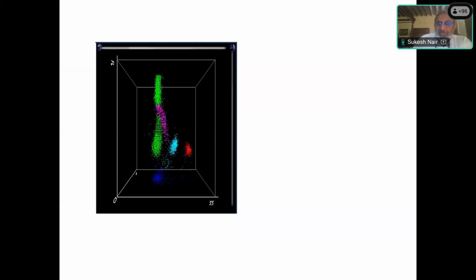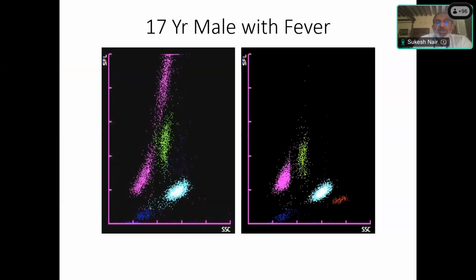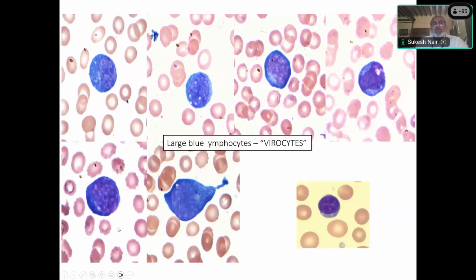got some abnormal lymphocytes, which are not lymphocytes, they're monocytes which are infected with the virus, because dengue virus is monocytotropic. If you compare to a normal person, you can see that he has an additional population of cells which are mononuclear cells, which are very intensely stained according to the fluorescence based on the y-axis. Because of virus, but it could also be because of the dengue virus, which are tropic to the cell and they're proliferating inside the cell.